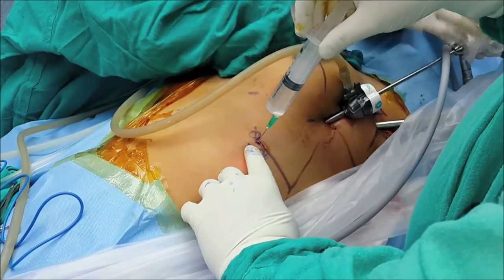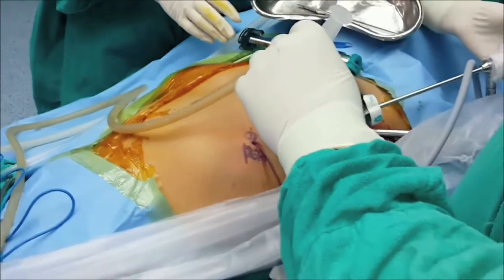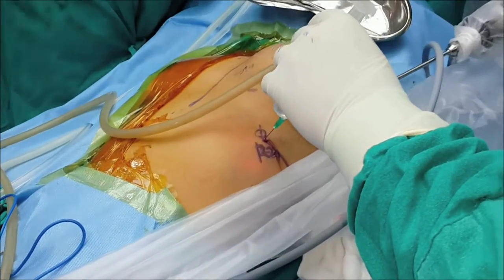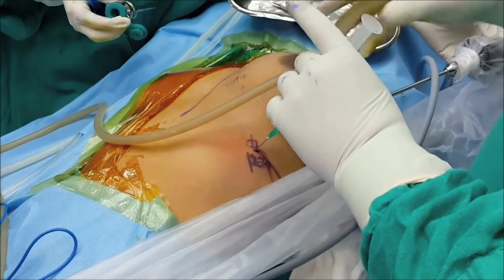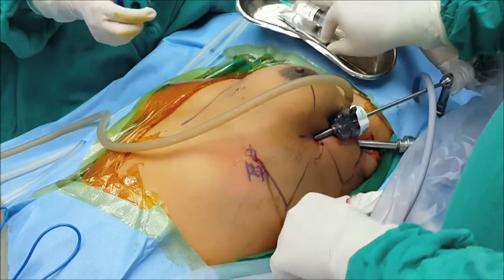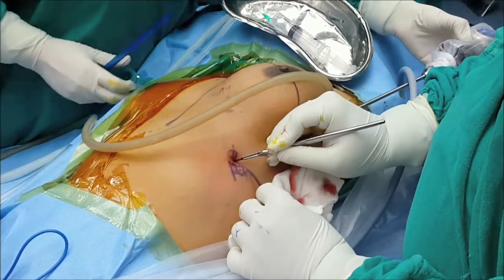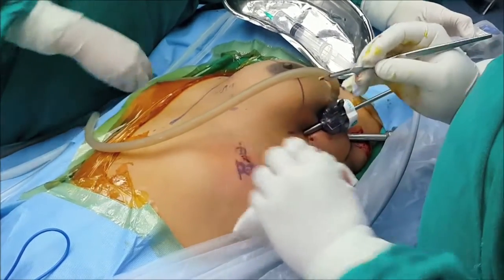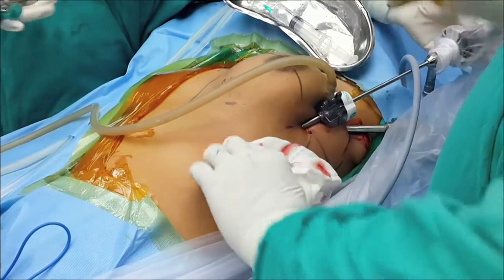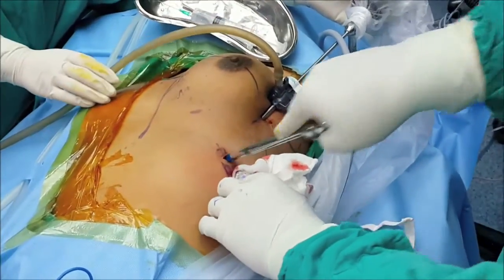We changed our port placement from a more medial to a more lateral position. This is the second port which allows us to do a complete radical dissection without having to swap our arms. When putting ports in the chest, it is very important not to exert too much force — control it and always do it under vision. I make the incision just enough for the ports to fit in very snugly. These are metallic ports and usually do not cause much skin burning or related problems.